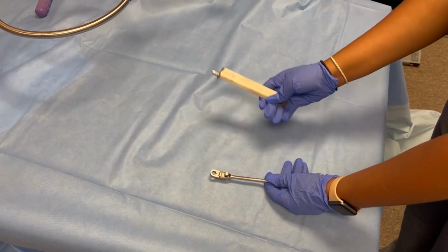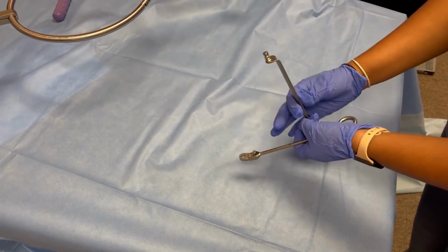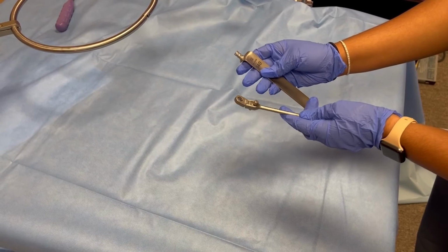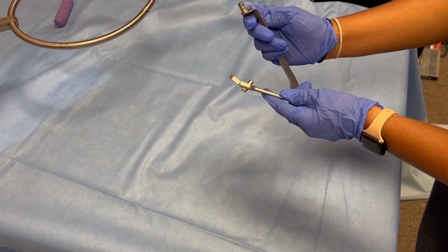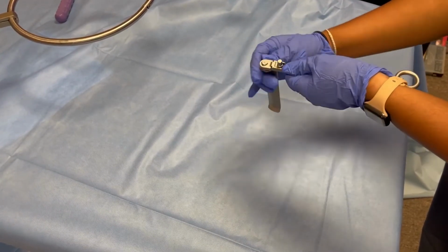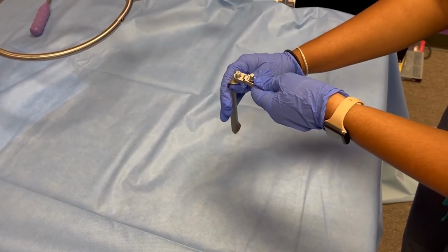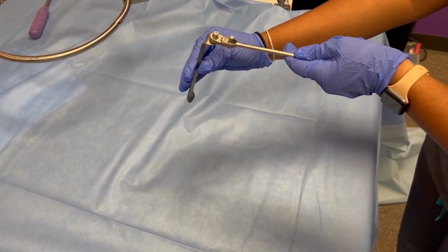Next, we're going to attach our blades to our Phantom AL blade holders. Our blades have a dual fixation connection, which allows you to connect the blade to the blade holder in a fixed or swivel position. So you'll see that these blades have 2 sets of pins. If you insert with the first set of pins into the blade holder, a swivel connection is achieved. If you would like a fixed connection, you're going to push up 1 more time, and now you've placed the blades in a fixed position.